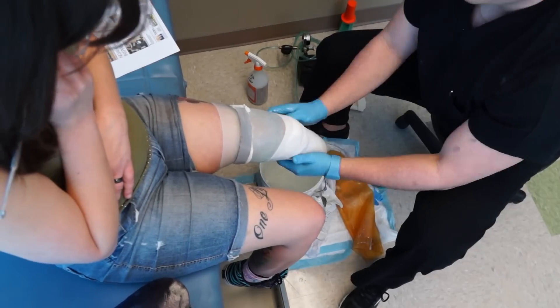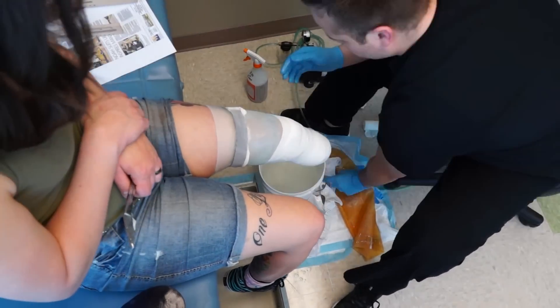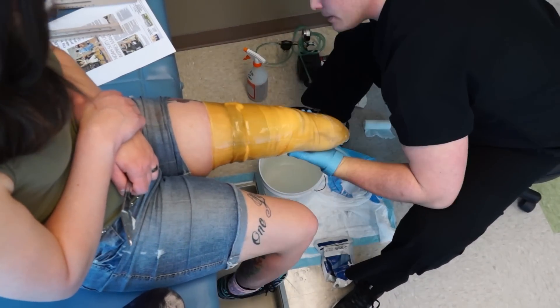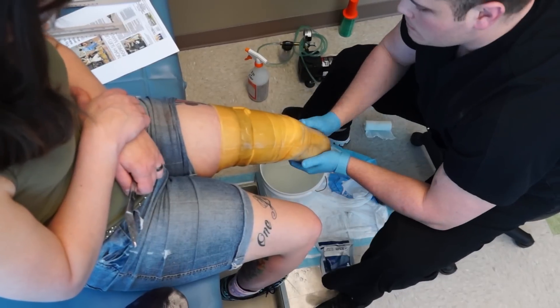Since I have to make things difficult for everybody, my prosthetist ended up just duplicating my check socket because it is super hard to get my socket right.